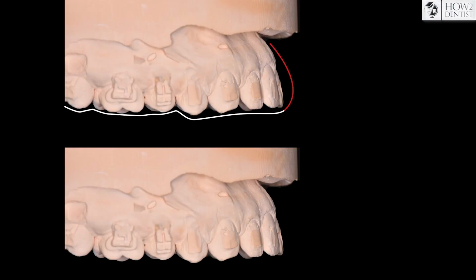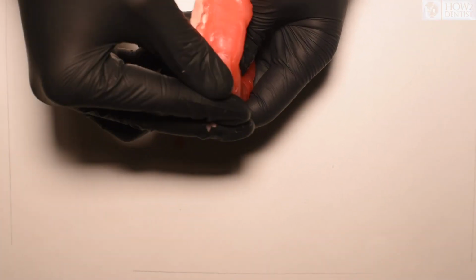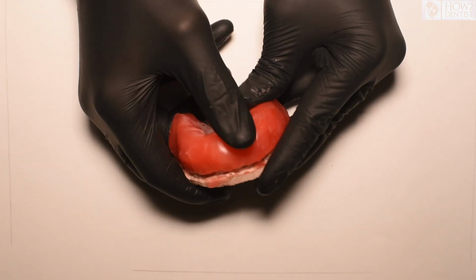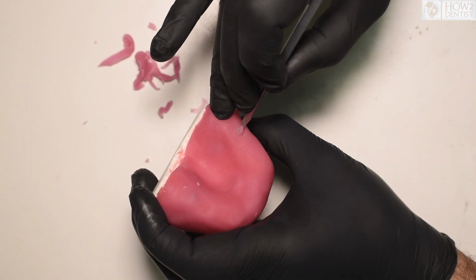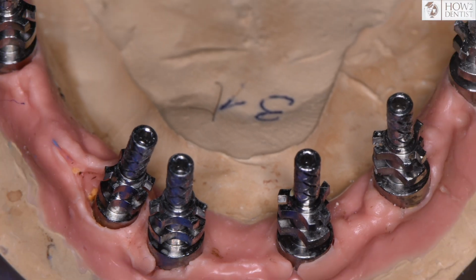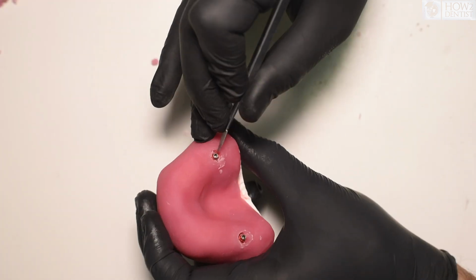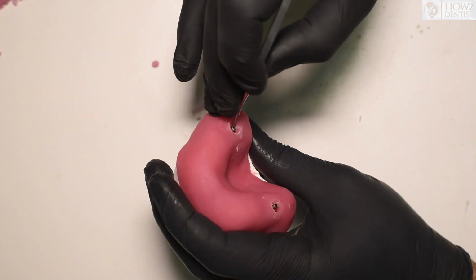In case of significant anatomy of the anterior alveolar process, do not press the tray close to the mucous membrane, repeating the anatomy, but rather isolate it with an additional amount of wax, since this will ensure a calm introduction and removal of the tray. If the impression is taken from implants, then in the case of an open tray, it is necessary to create openings for transfers. Therefore, the initial impression should also be taken using transfers, so the technician will be able to accurately place the holes where necessary and leave enough space for the transfer.